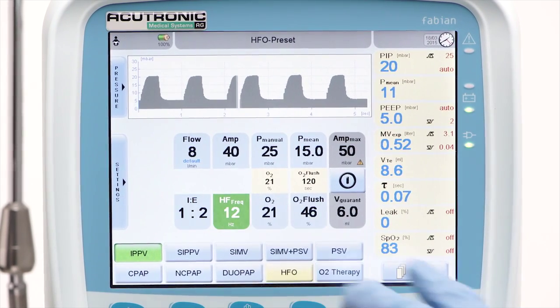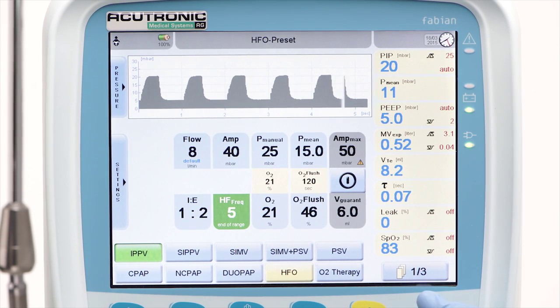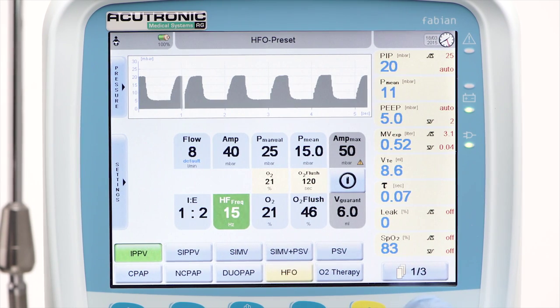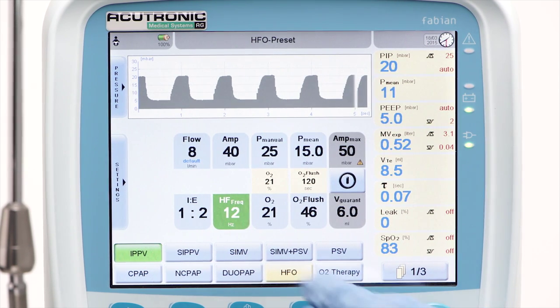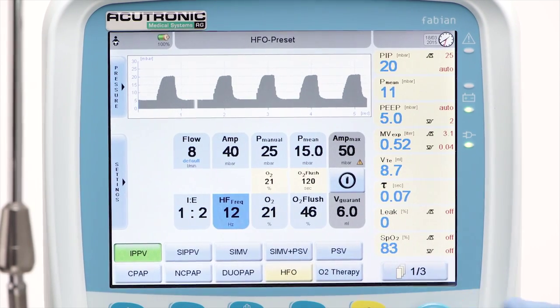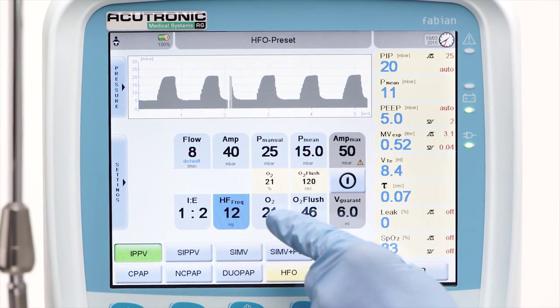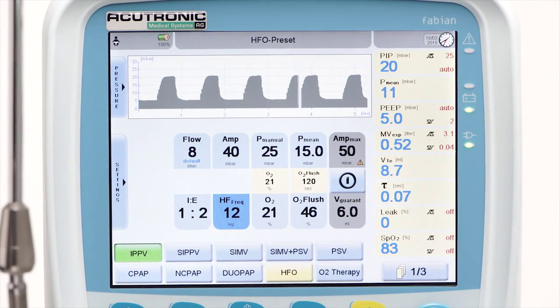The frequency is adjustable from 5 to 20 Hz. For preterm babies, you should start with 12 to 15 Hz. For term lung diseases, start with 9 to 12 Hz. FiO2 and O2 flush are also available settings.